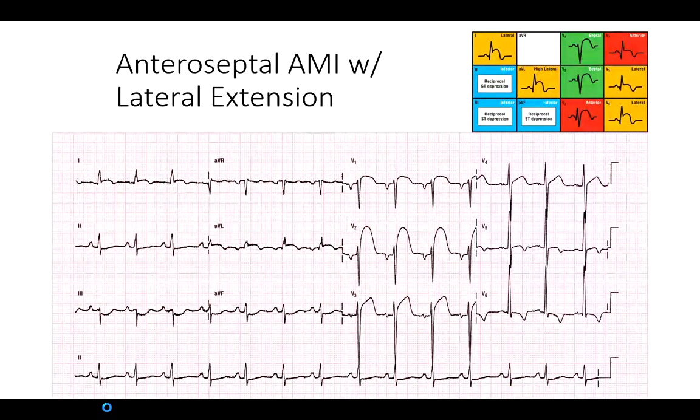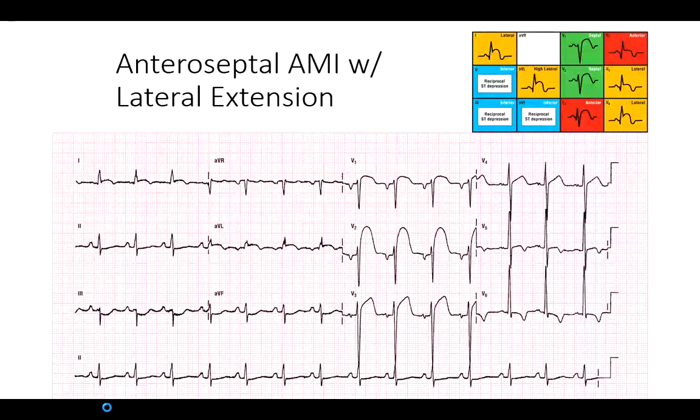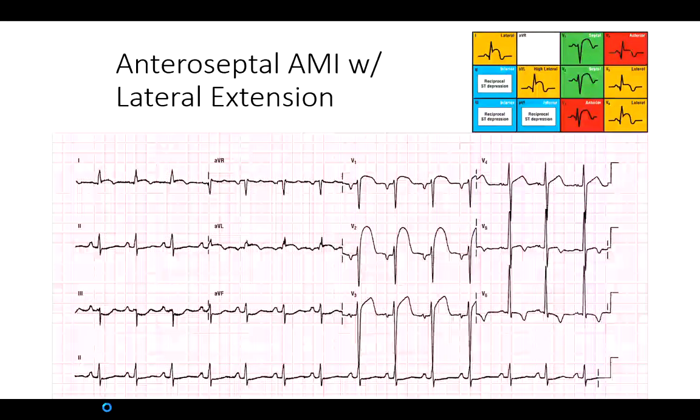So we'll conclude there, but please understand, gosh, there's so much more that could be discussed in terms of EKG and identification. And so I don't want anybody to think as they walk away from this, I can look at a 12 lead and I can identify the ailments and the pathology just from this lecture. That is not the intention of this lecture. That is not the hope that I had for you walking away, but rather just to give you some things so that when you hear a clinician speak about an ECG, it gives you a little bit more perspective and you can understand a little bit more of the language. Okay. Now, we didn't talk about a lot of different components, but gave you a very good highlight, and I hope that it was well received.